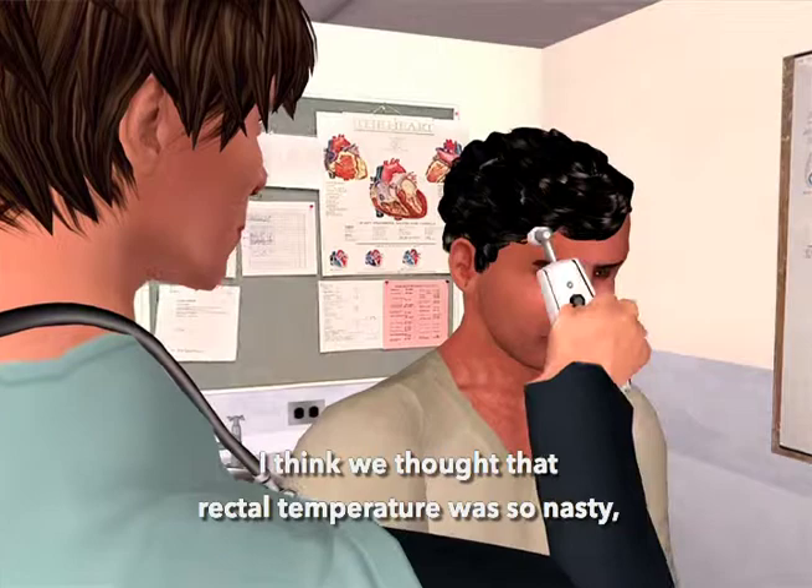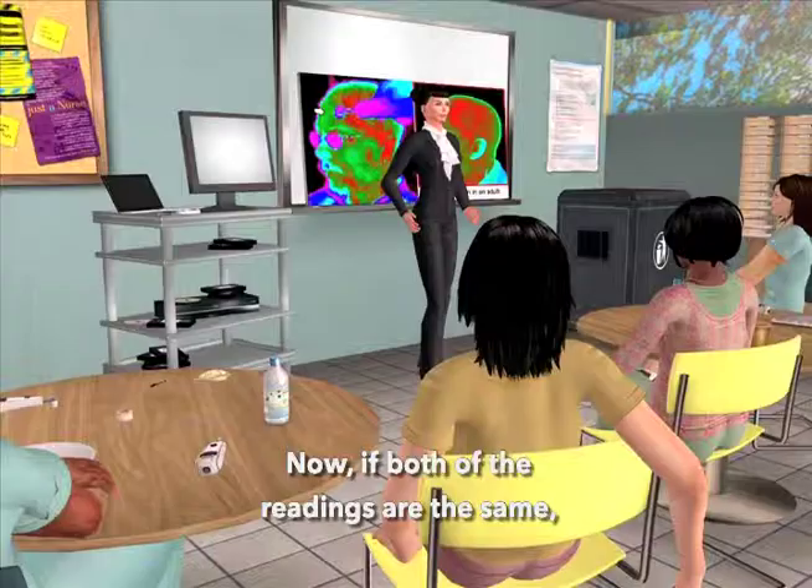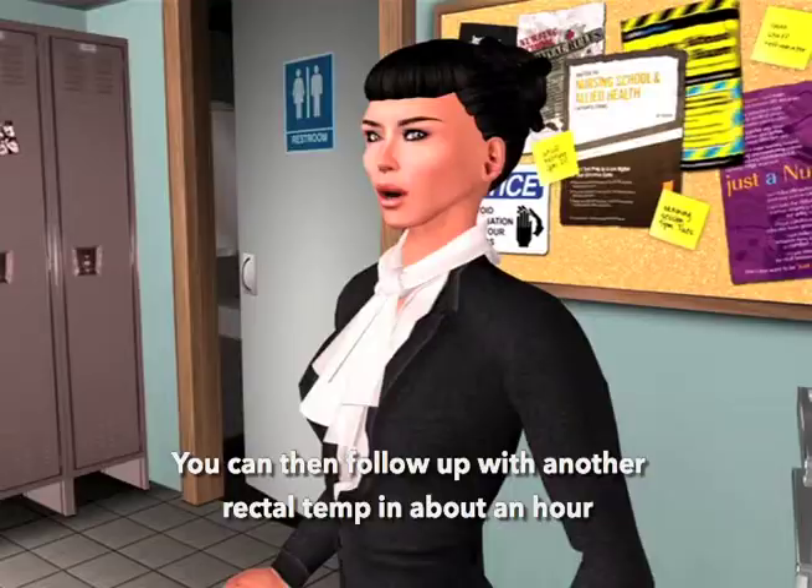The best way to confirm the reading of the temporal artery thermometer is to use a second temporal artery thermometer. If both readings are the same, that would be strong evidence in favor of the temporal scanner. You can then follow up with another rectal temp in about an hour to see which way the rectal is headed.